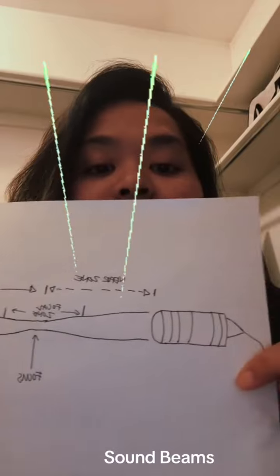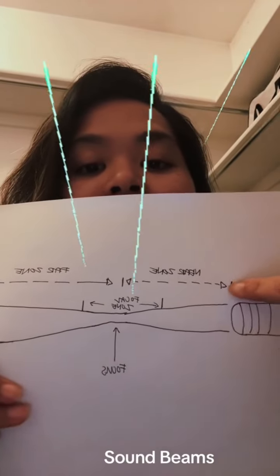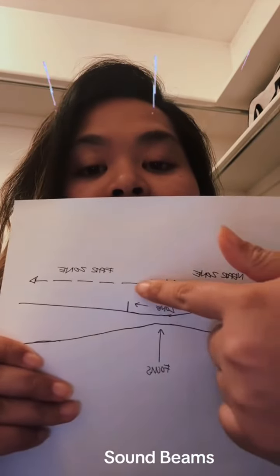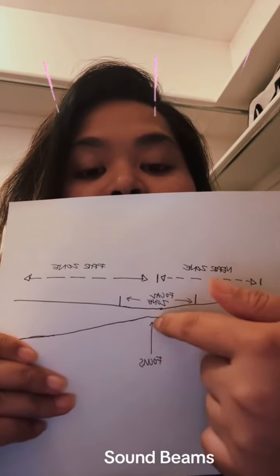Here is a picture for reference. So here's the transducer. Here are the zones. This is the near zone or the Fresnel zone, and this is the far zone or the Fraunhofer zone, and this is the focal zone, and the focus is right in the middle.